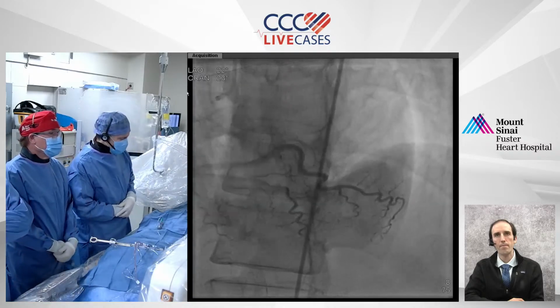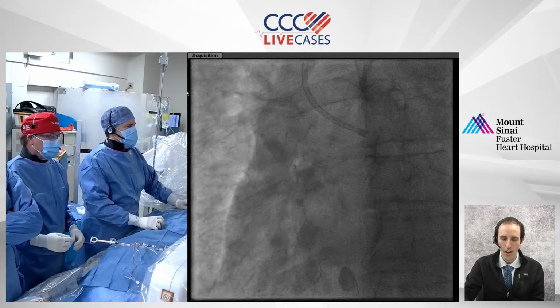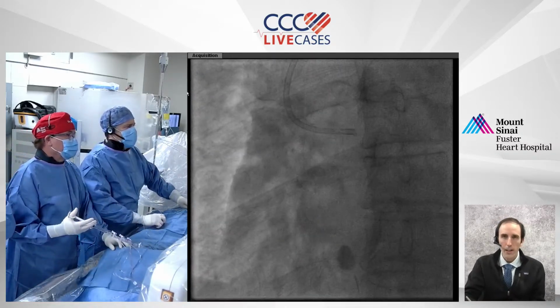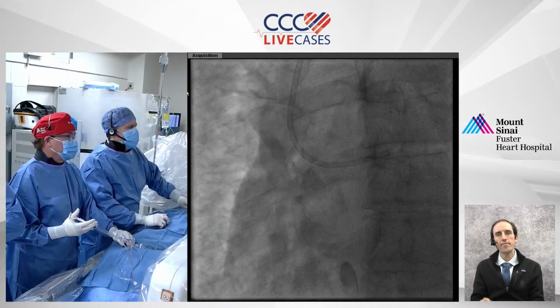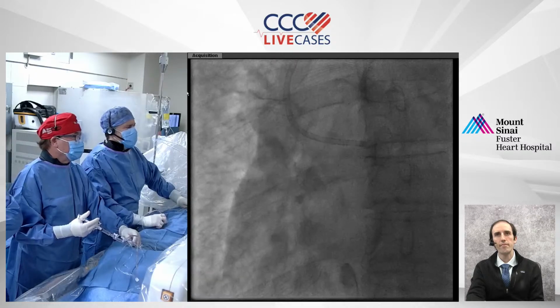So I think the CAT scan was correct. That's right. The CCTA doesn't lie when there's not a lot of calcium. Yeah, exactly. Now, I see you went femoral here. We did. What I typically do is I'm trying to do most of my cases radial.